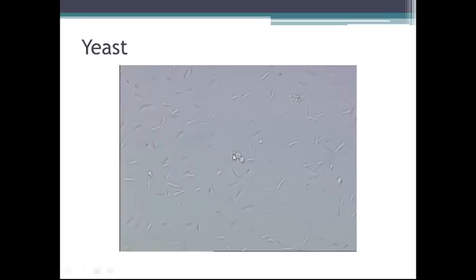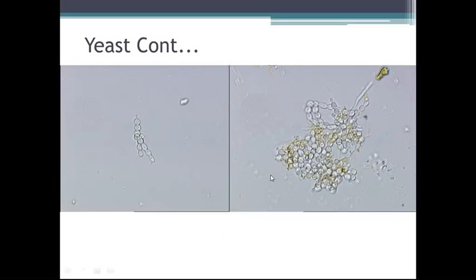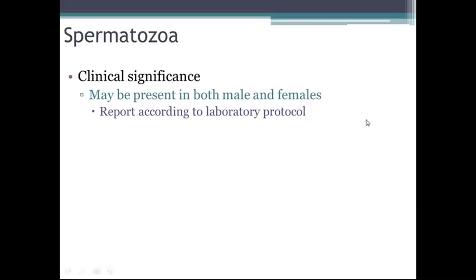So here's a picture of yeast. They are whitish yellow in color, usually when seen under a microscope. Sometimes you will have the presence of bacteria around. And yeast also bud. We call this budding, where they grow little links, and they link together. And here is a whole cluster of yeast growing, and then sometimes you will also have what's called hyphae, which will grow out little feelers.